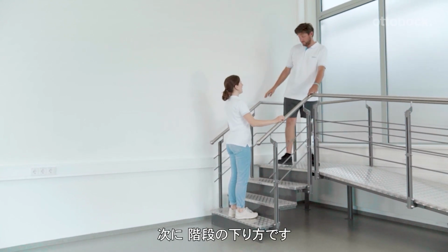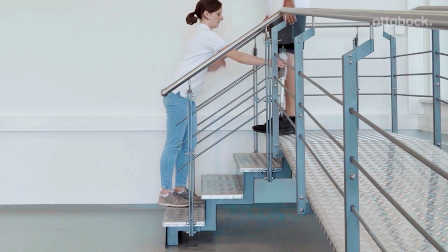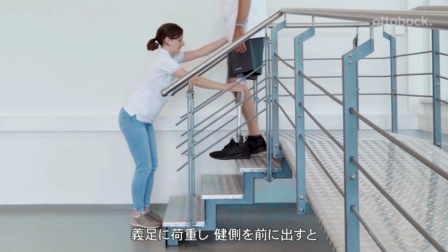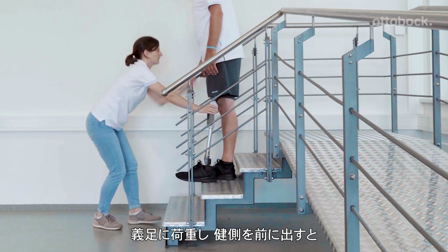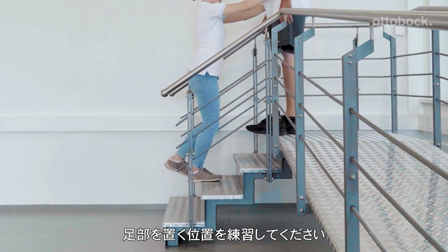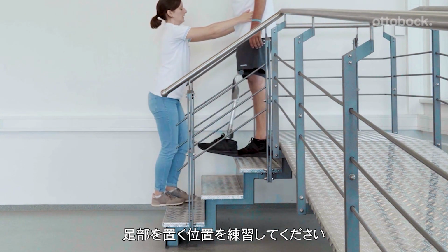Watch how our model places the prosthetic heel on the step. He keeps the knee extended, loads the prostheses, and then steps down with the contralateral side, which allows knee flexion on the prosthetic side. Correct placement of the foot is a common challenge.